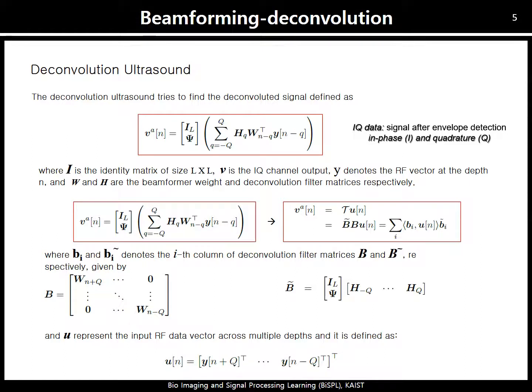So we divided the beamforming operation into two steps. One is related to the system itself, which is defined as the point spread function, and one which is only related to the object that we are scanning. So it's the tissue reflectivity function. The tissue reflectivity function can thus be recovered from the RF image using a deconvolution algorithm. And the quality of the RF image, which has an impact on the recovered tissue reflectivity function, is linked to the beamforming technique.